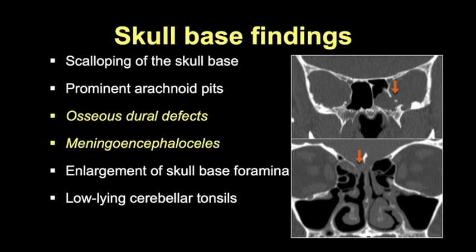In this patient, for instance, with a BMI of 56, you can see multiple skull-base defects. The first is one of the most classic sites of osseous defects in these patients, the inferolateral or pterygoid recess of the sphenoid sinus. But also you can see meningoencephaloceles along the already thinned cribriform plates and lateral lamella. And these are often subject to dehiscence, as is the case bilaterally in the same patient.